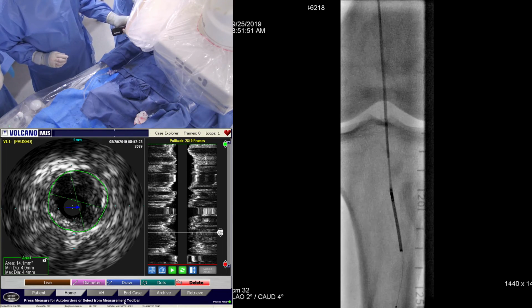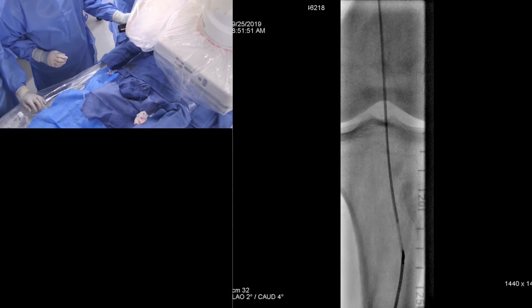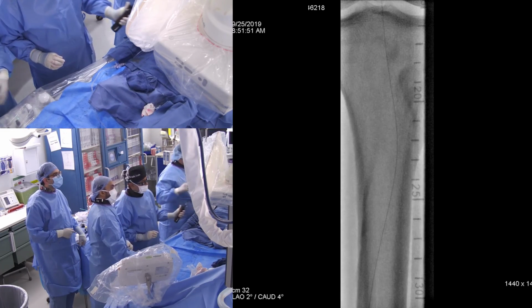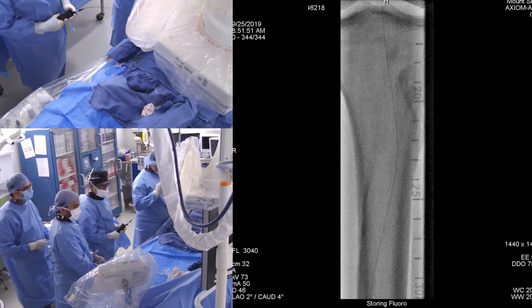Off. Because I am going to go into that trifurcation area. On, please. And get this spot right here. Always got to watch out for atherectomy bias. Off, please, because that can end up with a perforation. So give me a 4.0 100.